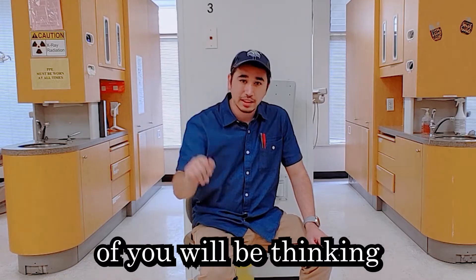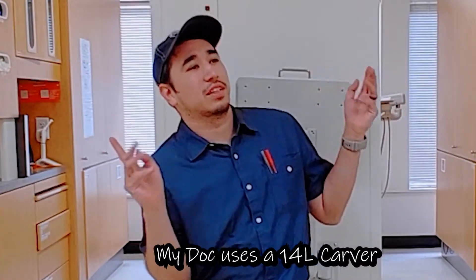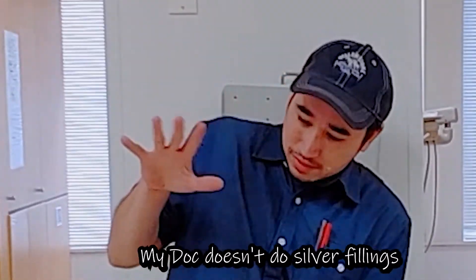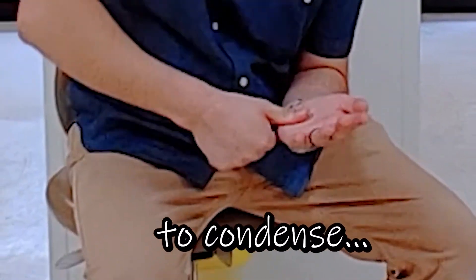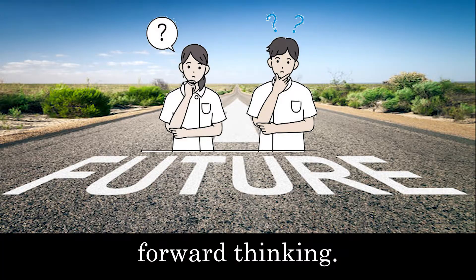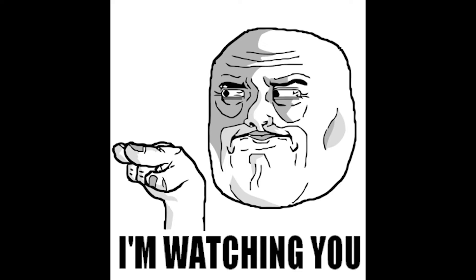Now, I know what most of you will be thinking, especially if you're seasoned. But Miller, my doc uses a 14-nil carver. My doc doesn't do silver fillings. My doctor only uses their thumb to condense. But hold on. This is an exercise in forward thinking. And also, those of you that are doing thumbprint fillings — well, I'm watching you.